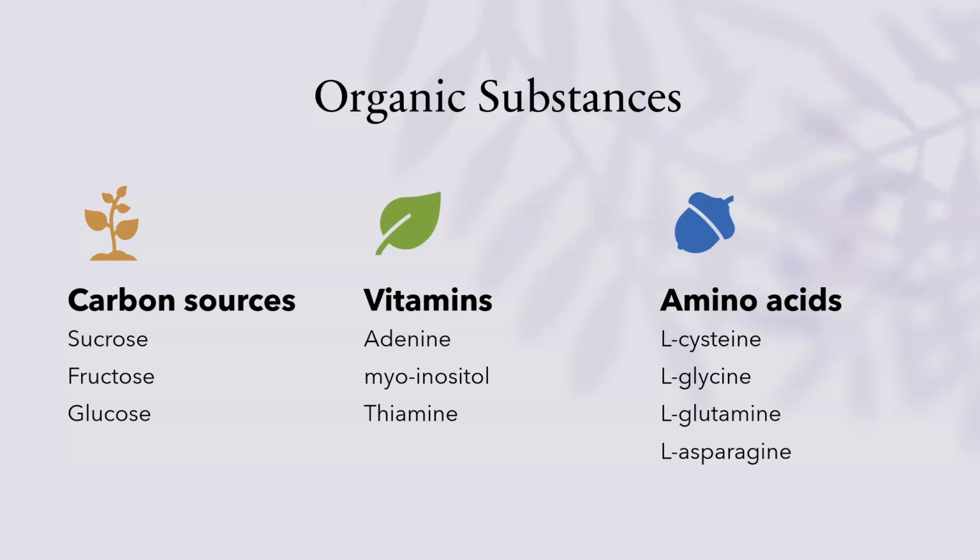Amino acids are building blocks of proteins, some of which combine with nucleic acids to form nucleoproteins. These nitrogenous substances are not essential, but addition of amino acids augments the nitrogen supply to media, which is important for specific cases like stimulating cell growth in protoplast cultures and also in inducing and maintaining somatic embryogenesis.